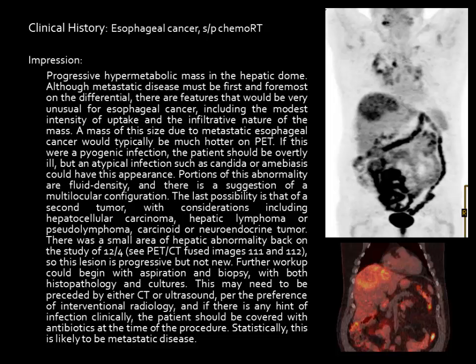Sometimes we'll see reports like this, and this comes from the fact that PET-CT scans can be very complex with a lot of different information. This is actually one of my reports from my earlier days where the impression was quite lengthy. And you can see that I had a lot to say in this report. But what I've learned over the years is when you feel like you have this much to say, it's probably best to pick up the phone and talk to the referring clinician because this becomes a conversation.